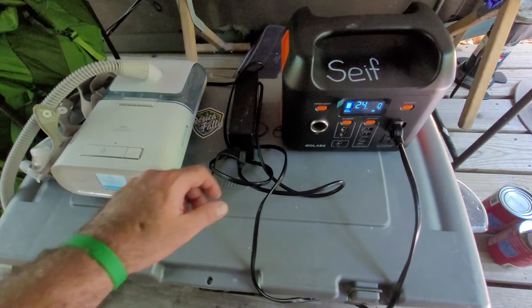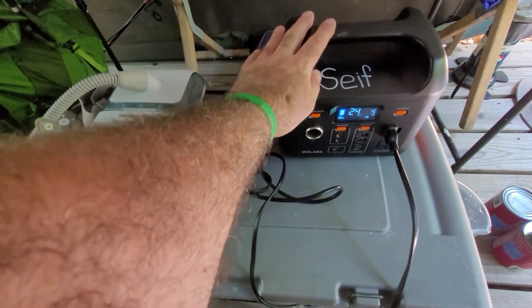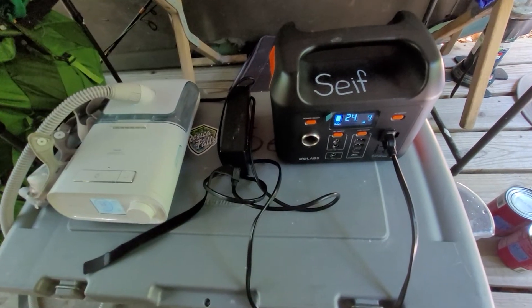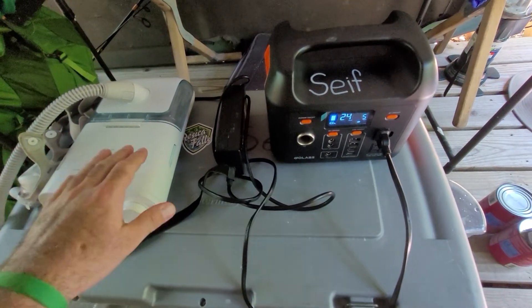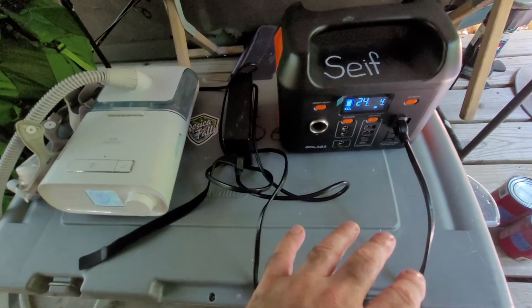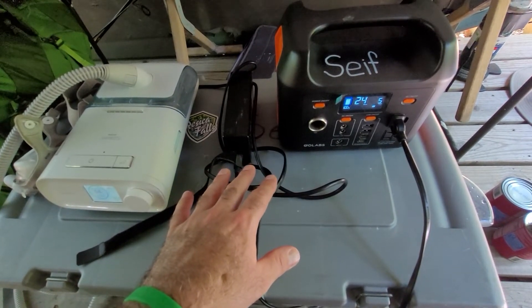The only drawback is if this is sitting a long time and I turn it on, it'll say 100%, but then I'll hook up my DreamStation and start using it and it kind of drops down to like 80%. That's the first time I've used it after it hasn't been used in a long time.